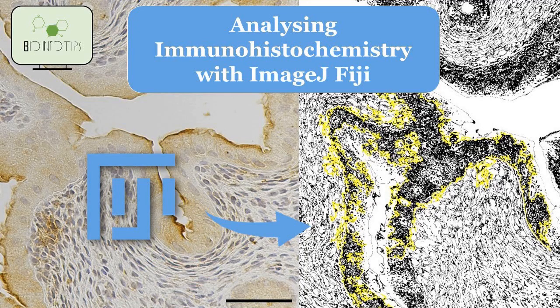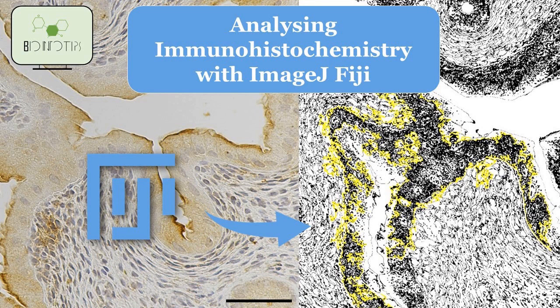Hello everyone, in this video I'm going to show you how you can analyze your immunohistochemistry slide staining using ImageJ.